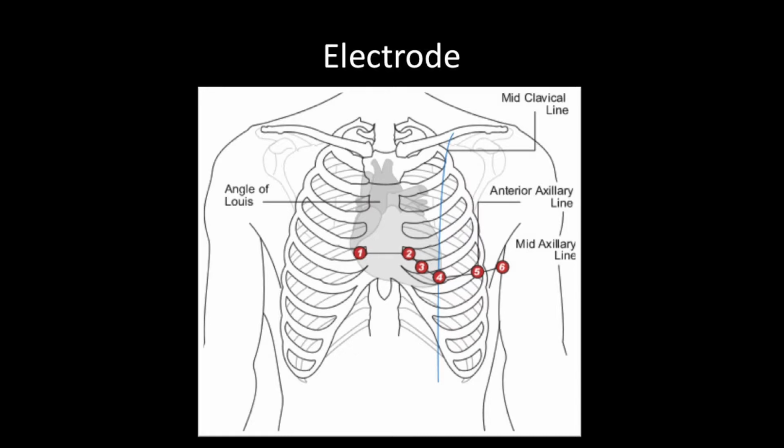Some people do that. Some people apply 6 in the mid-axillary line, so this is your axilla, right? From the front, anterior, posterior, somewhere in the middle, I find a line, I draw it straight down, I place 6. I'm okay with that. What I want to see is, it's not super clear in this picture, it's somewhat clear, that 4, 5, and 6 are in a horizontal line.